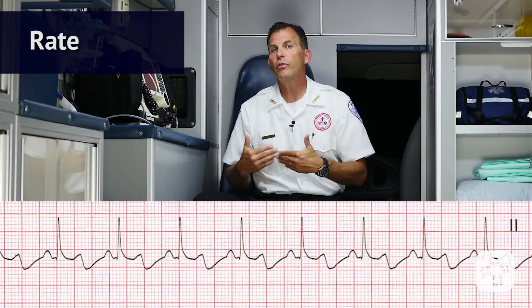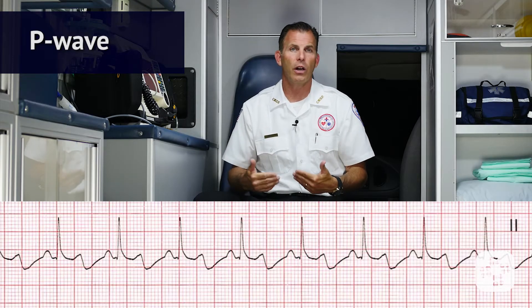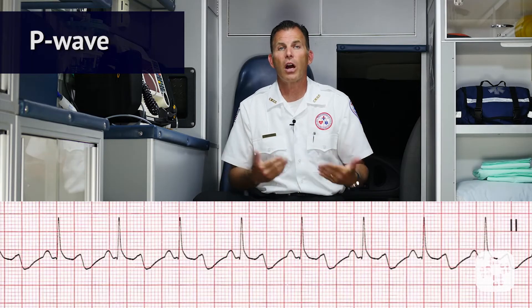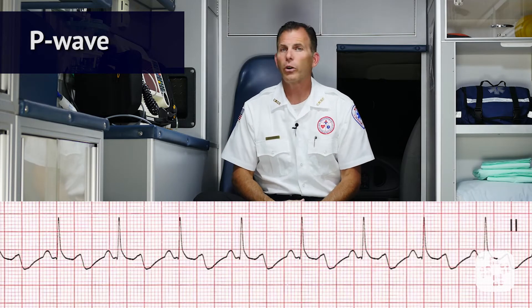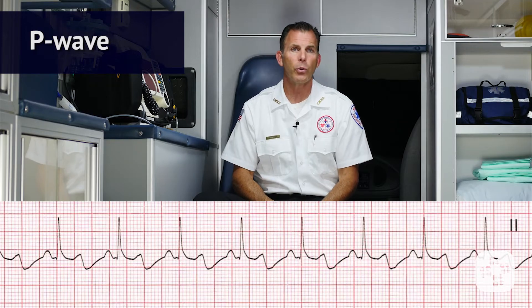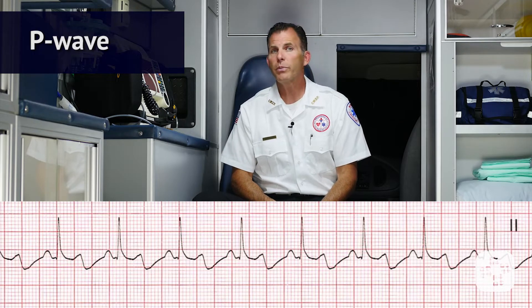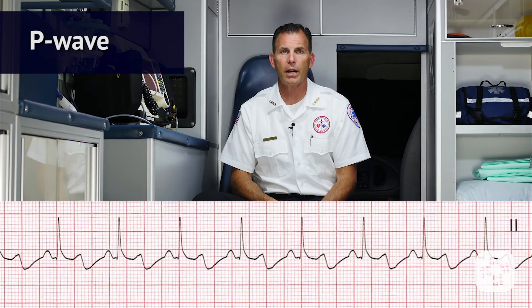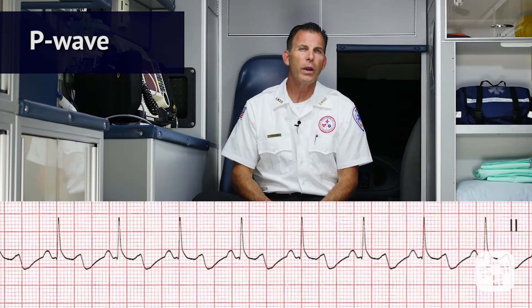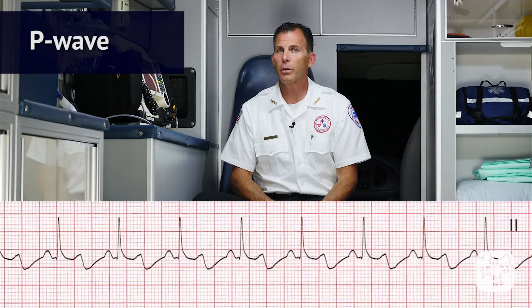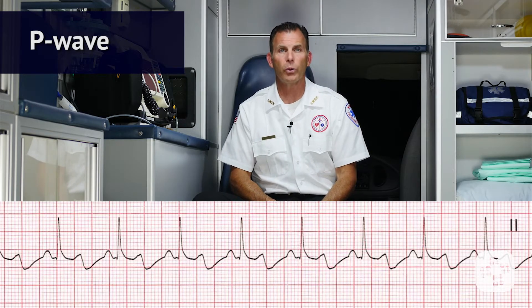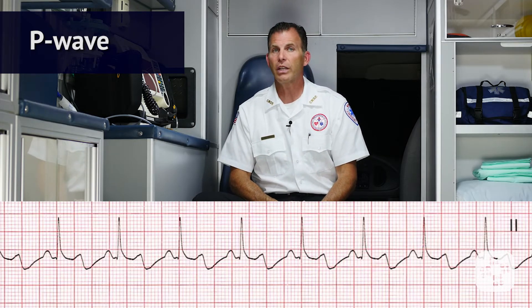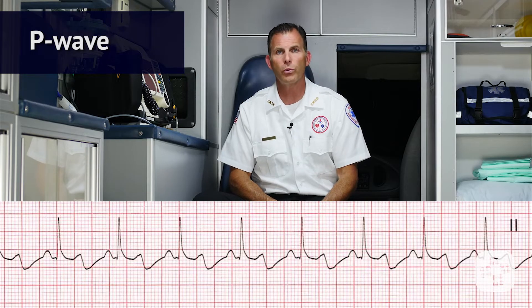Next we move on to evaluating the P wave. We ask ourselves: are the P waves present? We can clearly see in this ECG that the P waves are present. Do they occur regularly? We see that each of the P waves occurs regularly. Is there one P wave for each QRS complex? Yes, there is one P wave for each QRS complex. Are the P waves smooth, rounded, and upright? Yes, the P waves are smooth, rounded, and upright. And do all the P waves have similar shapes? Yes — each of them is uniform in shape, smooth and rounded.